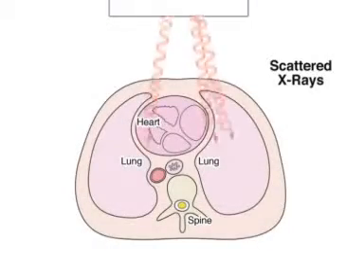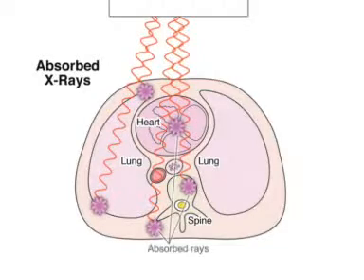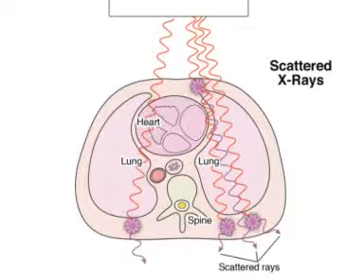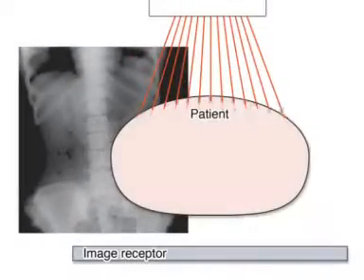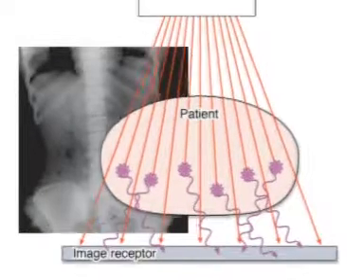As the X-ray beam passes through the patient, X-ray photons may be transmitted, scattered, or absorbed. The majority of the photons entering a patient undergo Compton scattering, and these photons often have enough energy to exit the patient and interact with the image receptor. Unfortunately, these scattered photons contain no useful information and often create fog on the image. This undesirable density decreases radiographic contrast, an important diagnostic quality of the image.